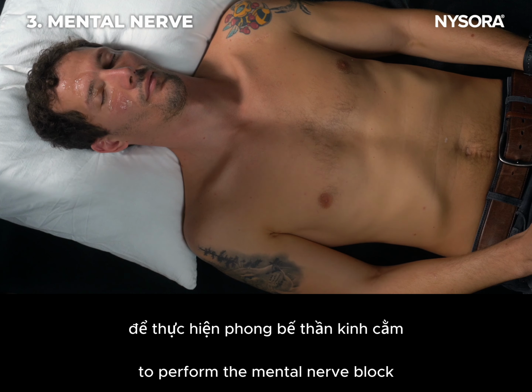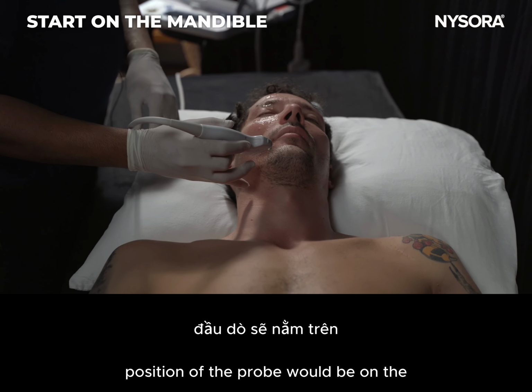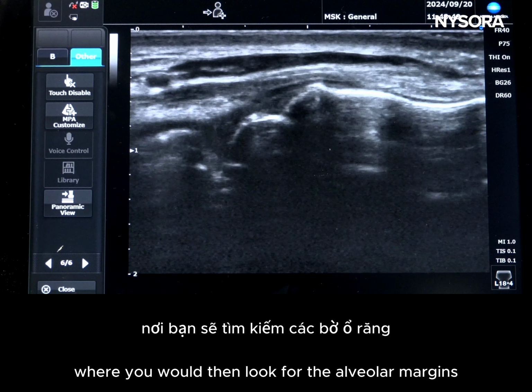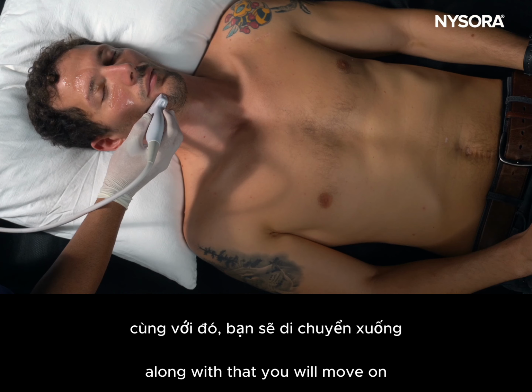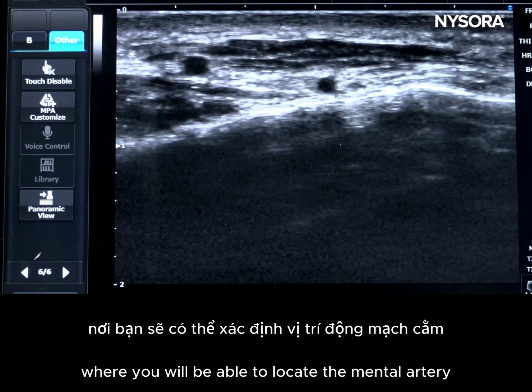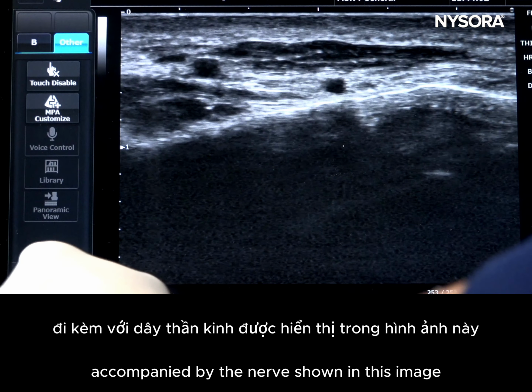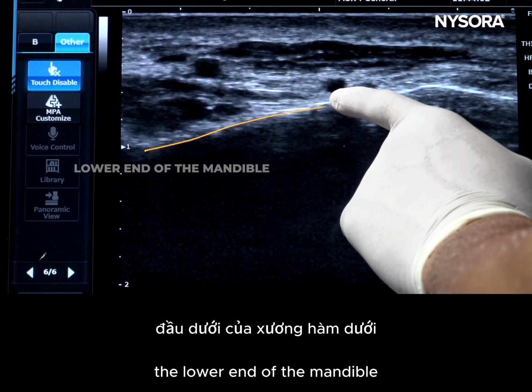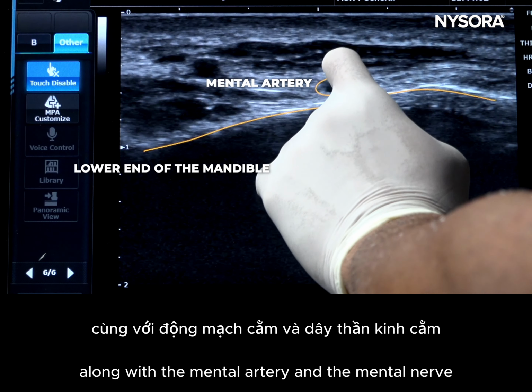To perform the mental nerve block, the position of the probe would be on the top of the mandible, where you would then look for the alveolar margins. Along with that, you will move down caudad, where you will be able to locate the mental artery accompanied by the nerve, shown in this image, where we have the lower end of the mandible along with the mental artery and the mental nerve.